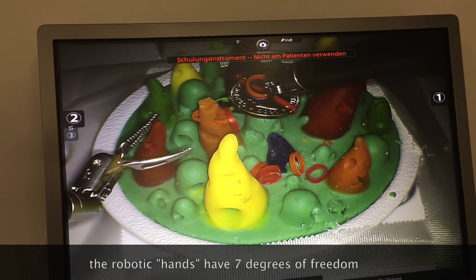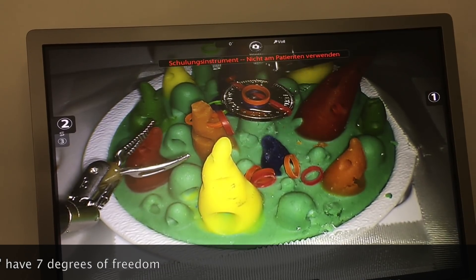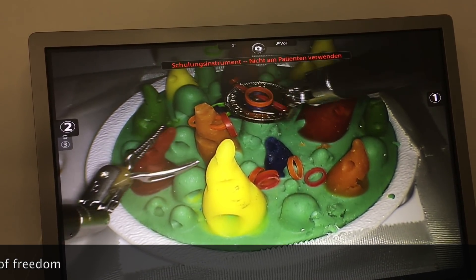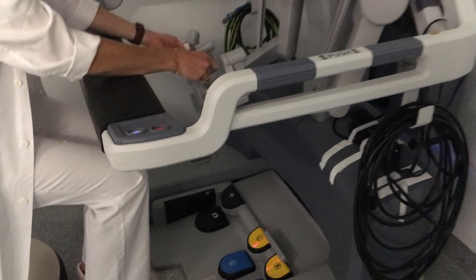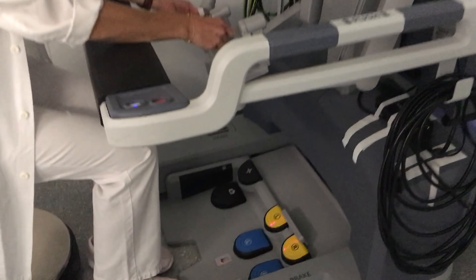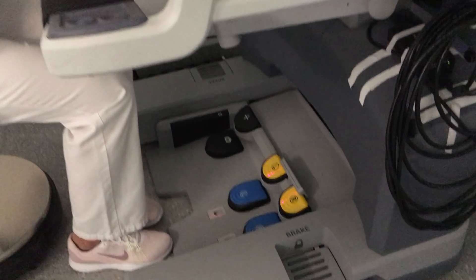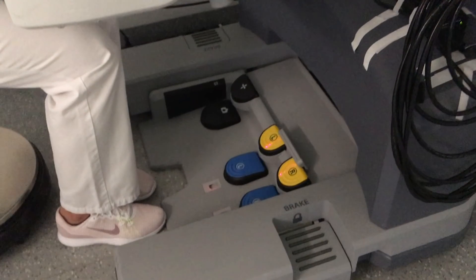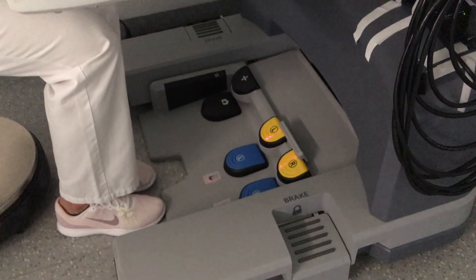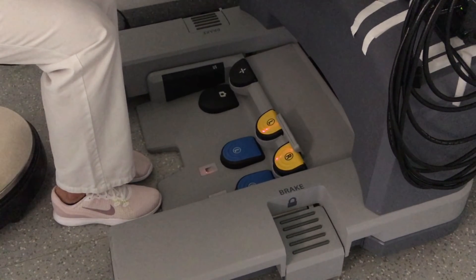Someone placed a Swiss 20 cent coin inside the cavity. There are also lots of pedal buttons — the left one with the camera symbol lets you move the camera when you press it; the others on the right side are instrument functions like cutting or burning, depending on the instruments you use.